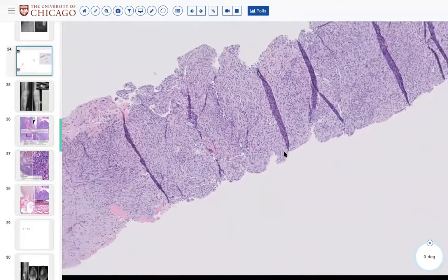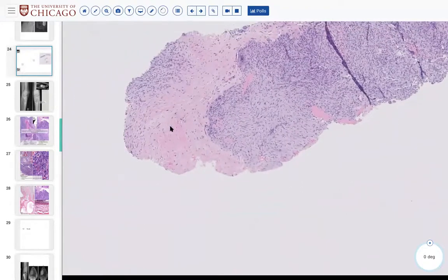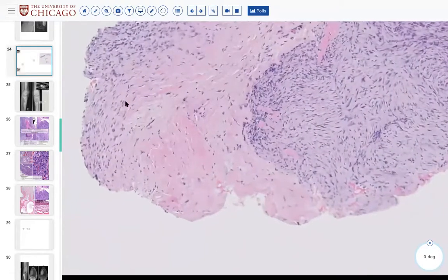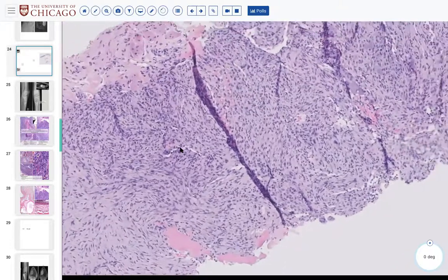And what is the unifying factor of both of those? If I haven't drilled this into your brain yet. USP6. Yes, excellent to both of you guys. USP6. So nodular fasciitis-like appearance in bone, always think about aneurysmal bone cyst.